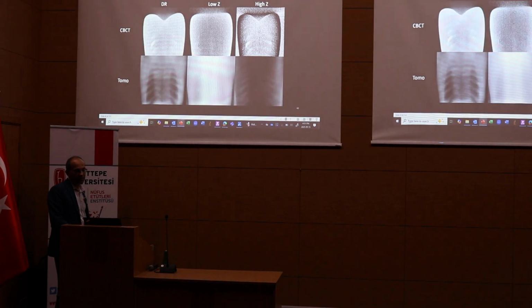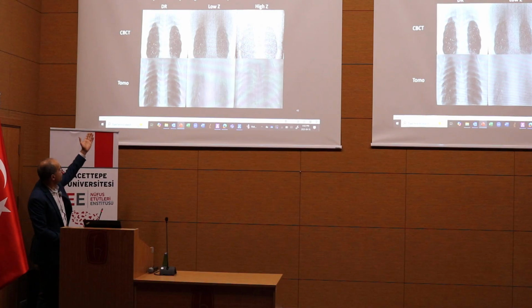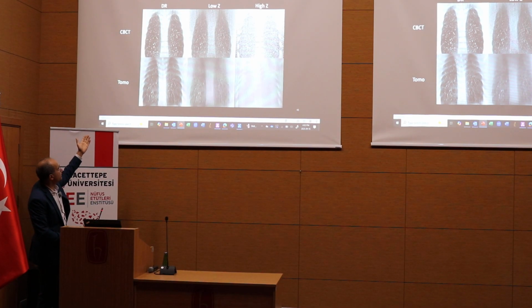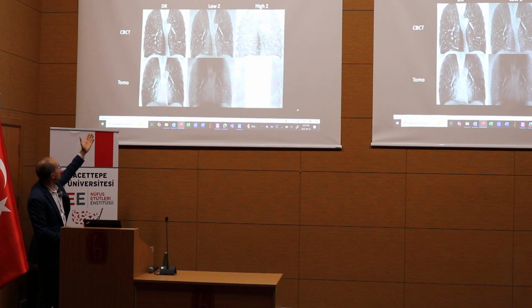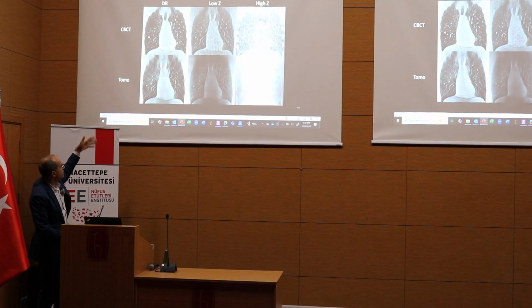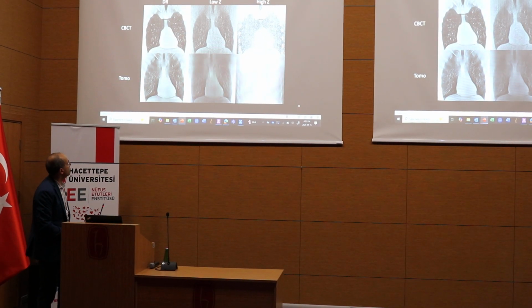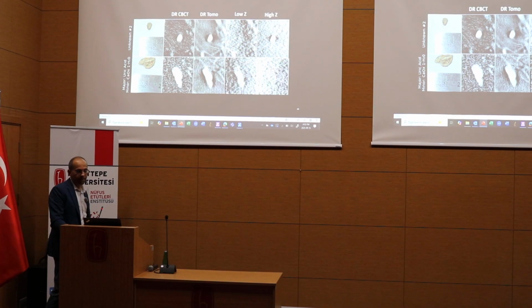So we've done tomosynthesis work with this type of detector, and for sure you can see the same type of benefit in 2D, you can see in 3D. In this particular case, the noise is a little high just because of the way we took the images with very low dose, but some algorithms can clean this type of stuff up. But the point of this is really, there's a lot of future for this type of technology.